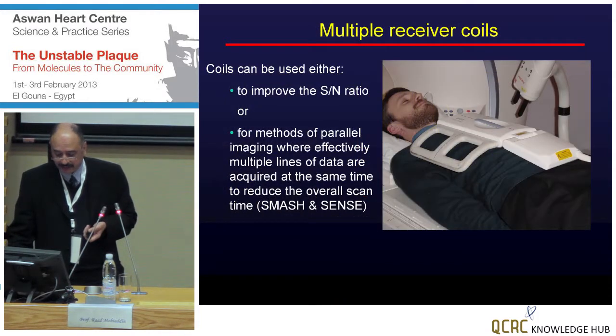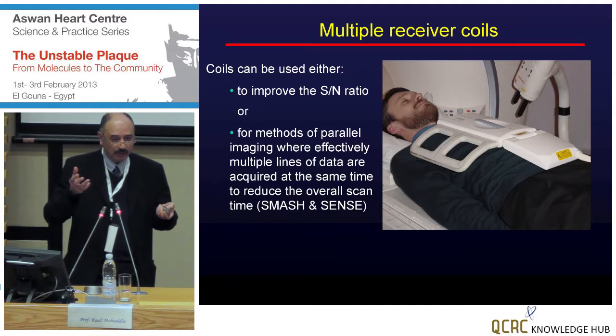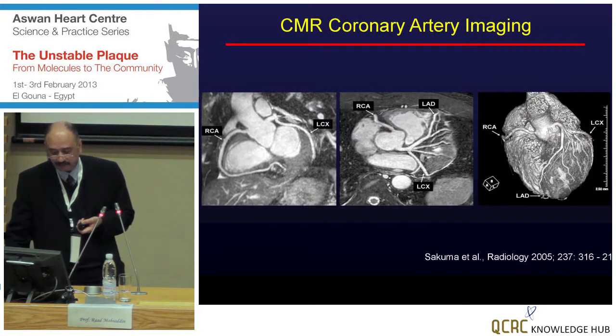The other problem is that, not unlike the carotid arteries, where you can stick the surface coil, which is the receiver, like the antenna of a television or radio, to receive the signal, the coronary artery is deep in the chest, so it is not so close to it. And that's, again, why it is more challenging to look at the coronary arteries. This is a coronary angiogram looking at the lumen in this case, and you can see that, properly done with this type of respiratory compensation, you can get good anatomical details of the vessel itself.